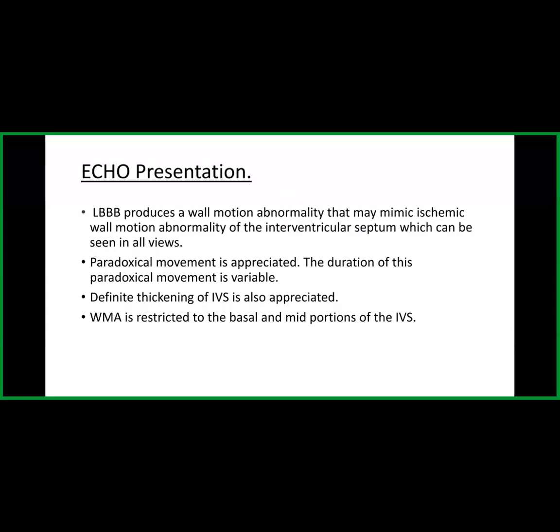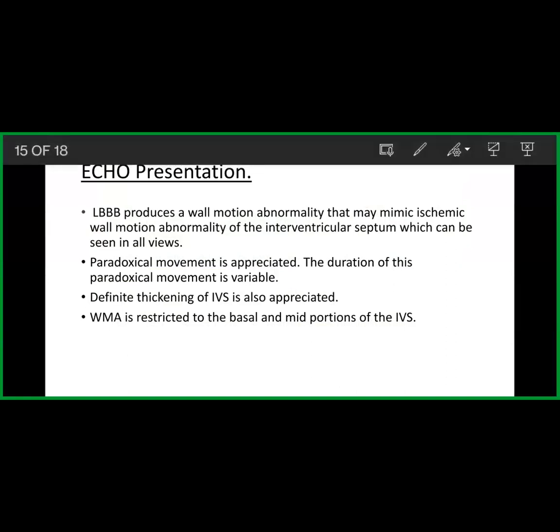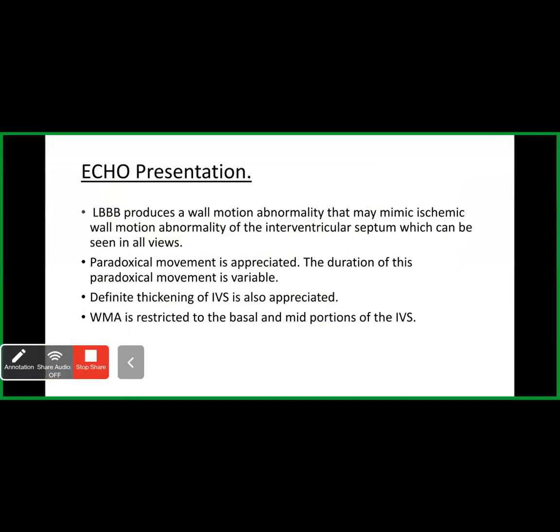Before we continue here, allow me to pull up what exactly this will look like in a case of left bundle branch block quickly.